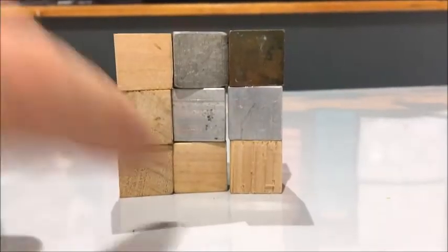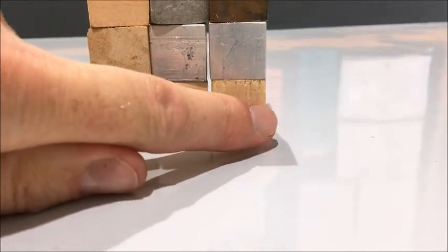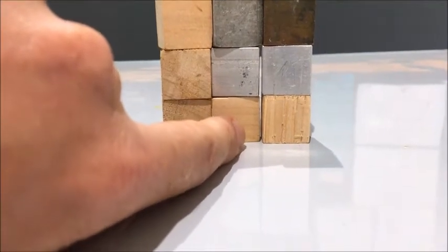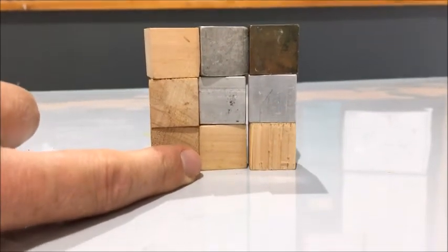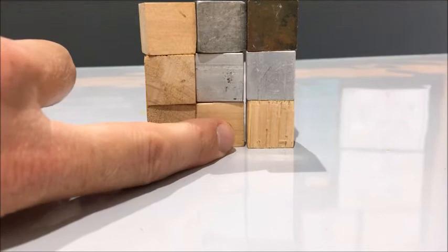If I want to deduce what this one is, I actually have to go through from several angles. So I go through there first of all, and that will give me a value. And then I can come through in this direction as well, and that going through there and there will give me a value. And then I can go through here, and I can get a value, and then come through from this direction as well. And all of those things together will help me find out how absorbent that is. And it will eventually give me, through numbers, a value of the absorbency of what that is, and it would translate that onto the image as a more or less dense thing. So this one is going to show up more dense than that one from this deduction.